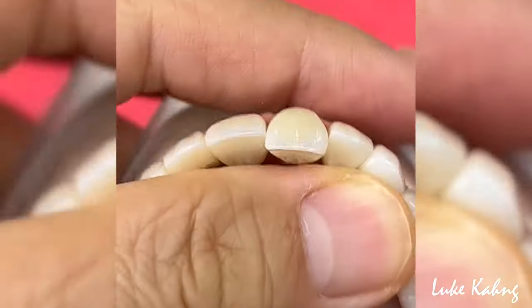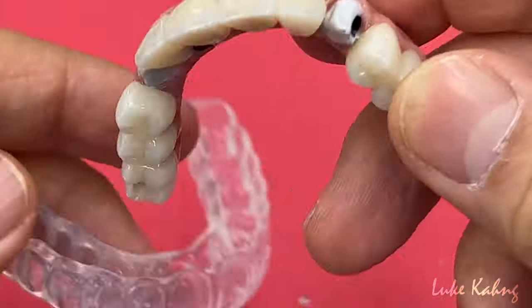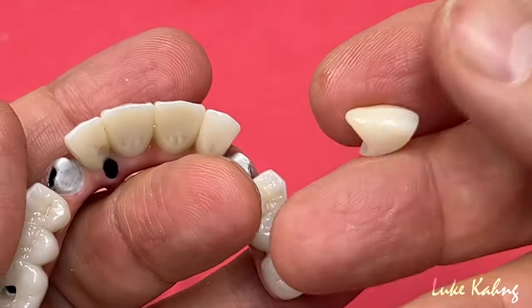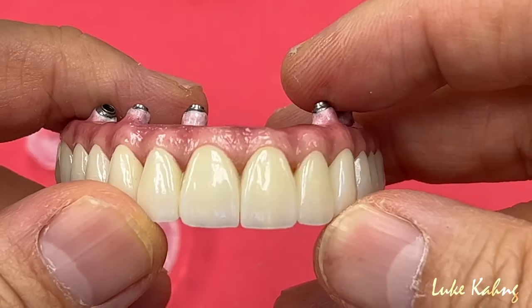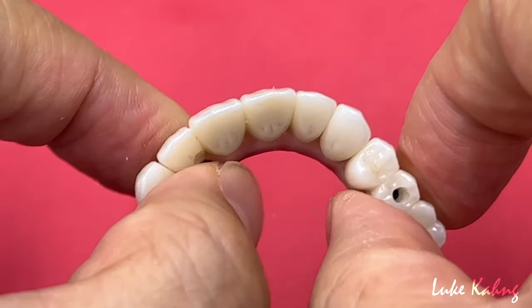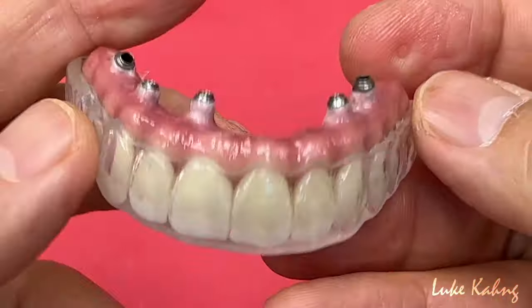Yeah, we're going to cement soon. Finished final product after cementation. Give them the extra 2 crowns. So doctor, we're going to cement it chairside temporarily. Then another is great. Beautiful restorations. Exceptional cases. World class case too. All right, thank you.